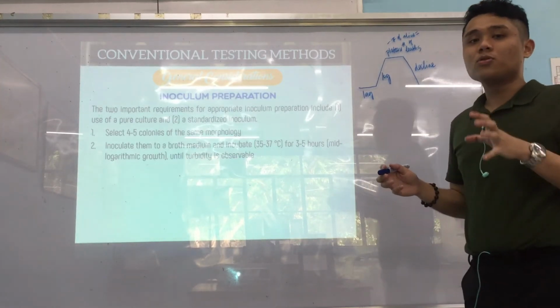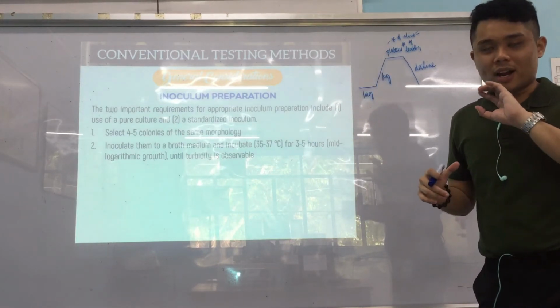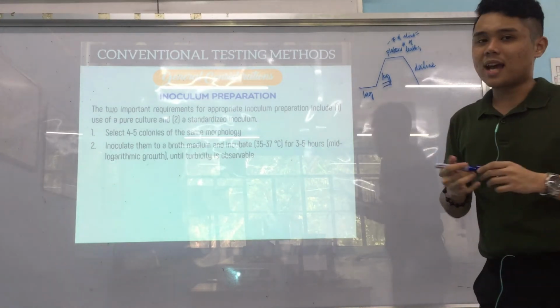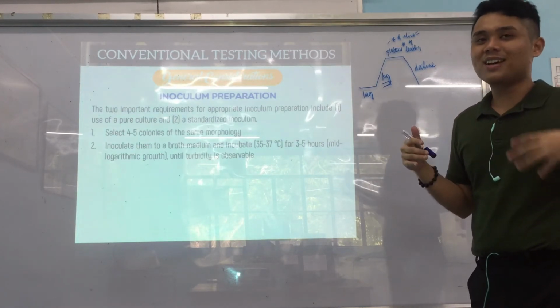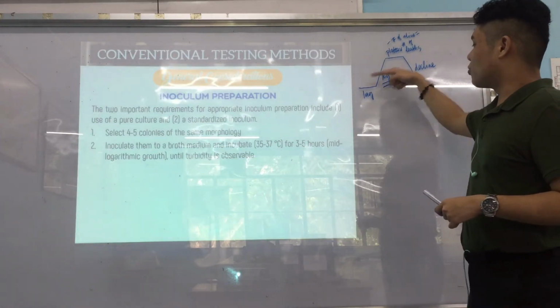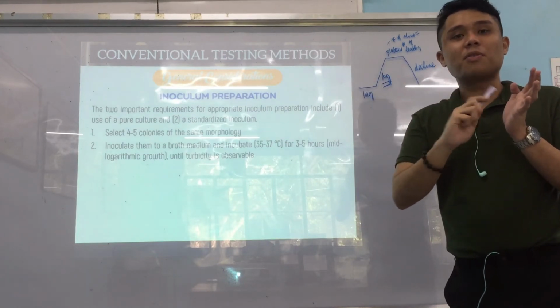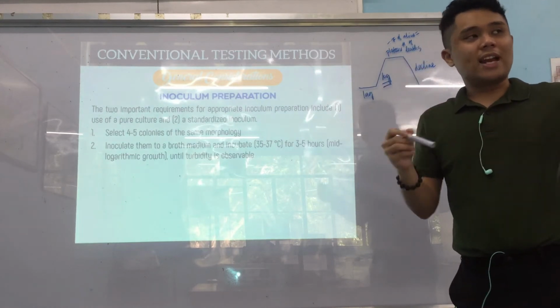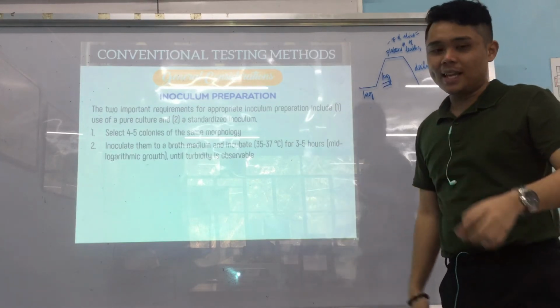Alright. So if pangutanan mo unsa na phase sa imuhang bacterial growth, kanang pwede mag-test for AST dapat sa log. Okay? Because again, they are actively replicating. Alive pa kayo ang kagaw, no? Fresh pa sila, no? Alive na alive. Okay? Alright. So muna siyang dapat nasa mid-logarithmic. So sa tunga-tunga. Ayan. So that's one method. You get 4 to 5 colonies from your plate using a swab usually or pwede loop, and then immerse in a broth, then incubate in your incubator for 3 to 5 hours, and then look for turbidity.